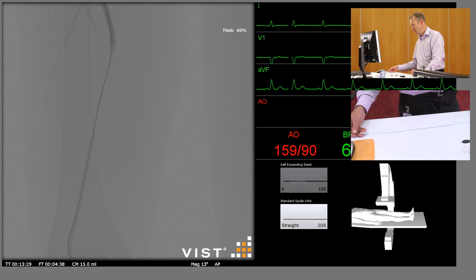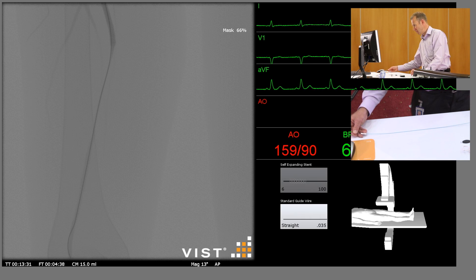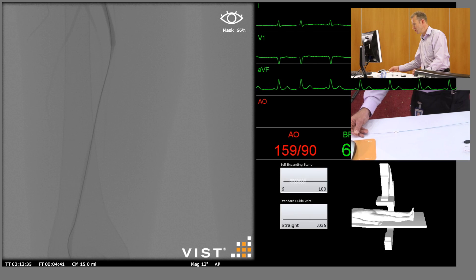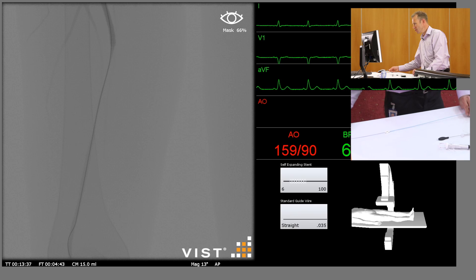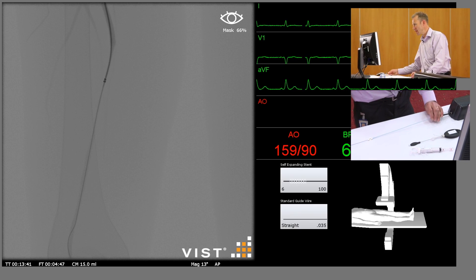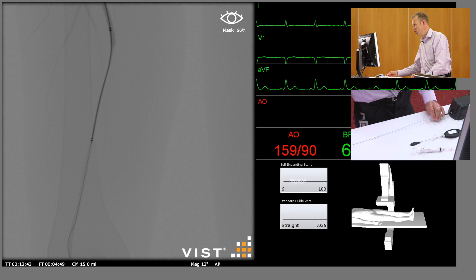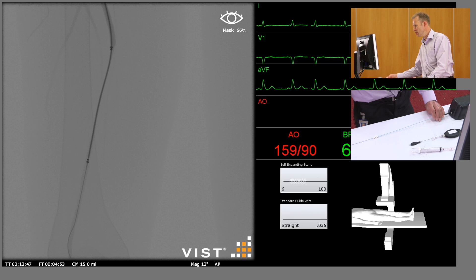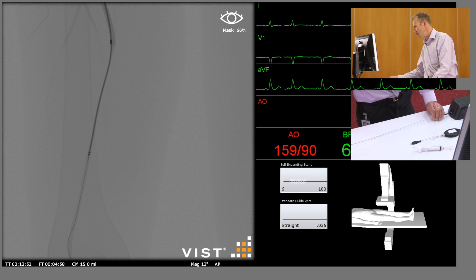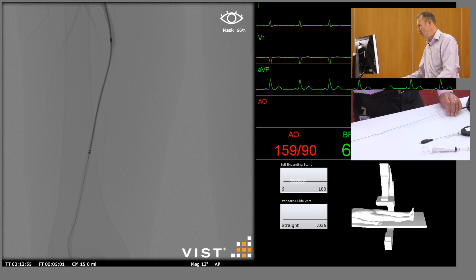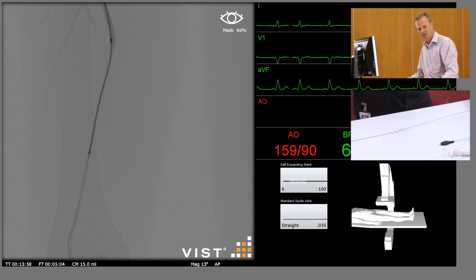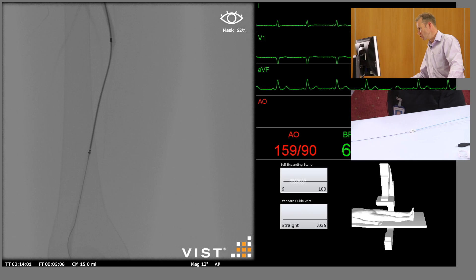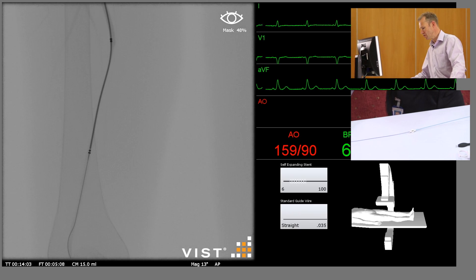Now we've selected our stent and we're just going to insert the stent. As in performing an angioplasty, I'd also give intra-arterial heparin 3000 units prior to deploying this stent or a balloon. I think this 10 centimeter stent is going to be long enough. We've got normal vessel below and normal vessel above. We're just going to decrease our digital subtraction to show the deployment of the stent.